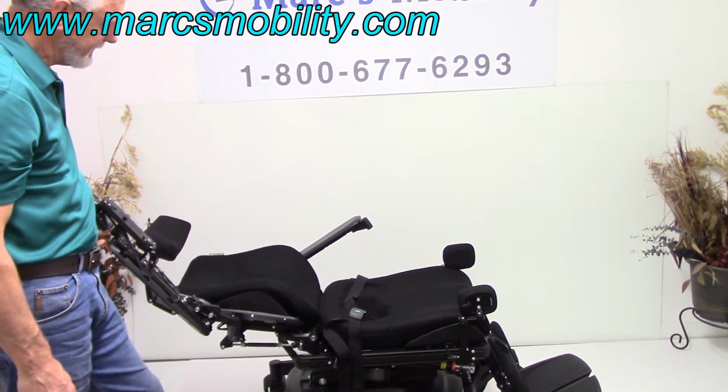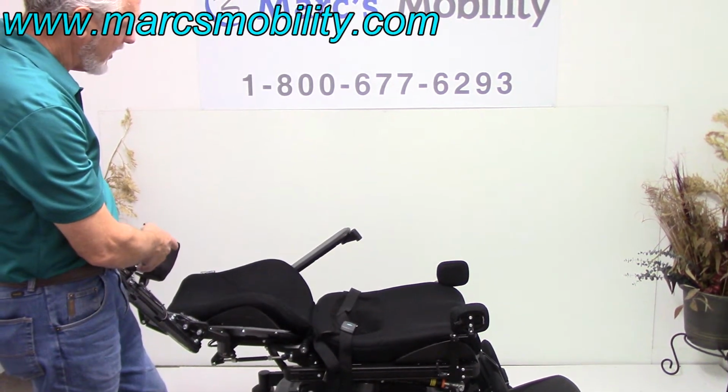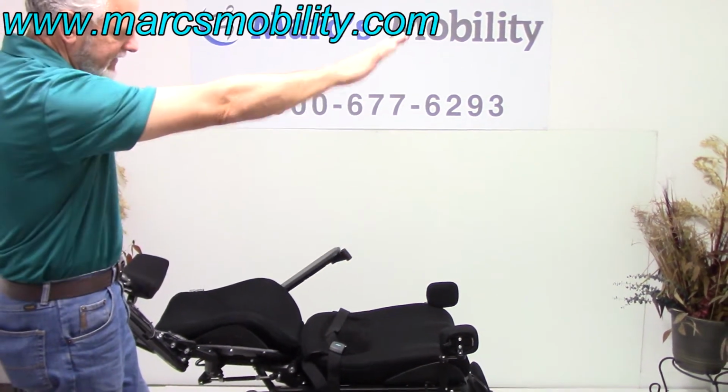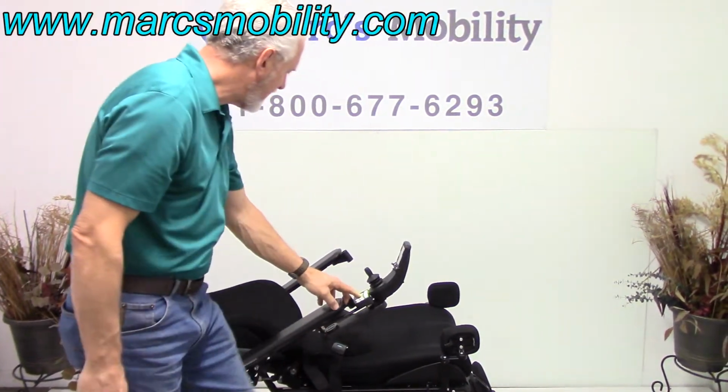So it's almost flat. Well, it is flat. So this is your full recline, and you can have your legs up and be laying flat completely. So I'm going to bring the recline back up.